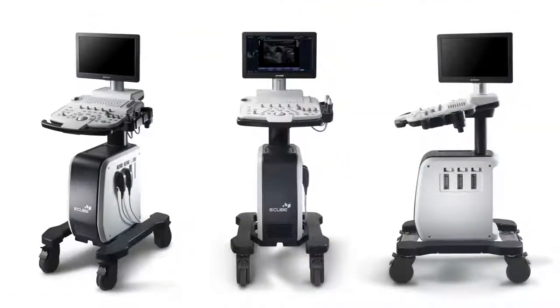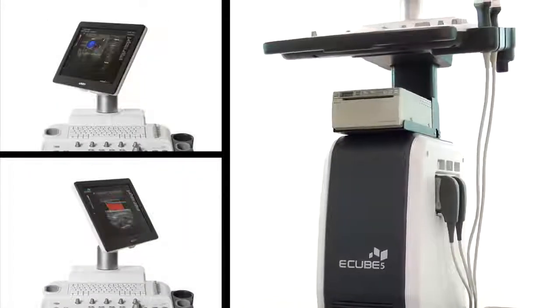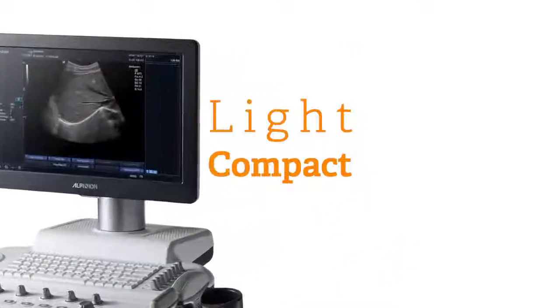Little details make the E-Cube 5 feel well-built, like the backlit buttons, keyboard light, angle steering, and optional analog output that allows you to use your existing printer. The unit is very light and compact and is, in our opinion, the most silent unit made.